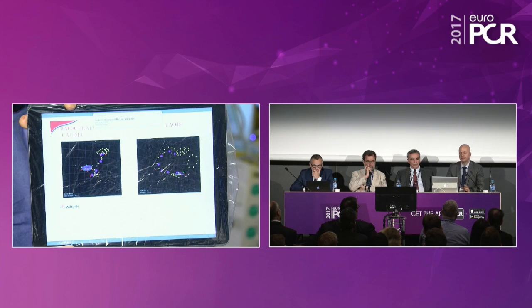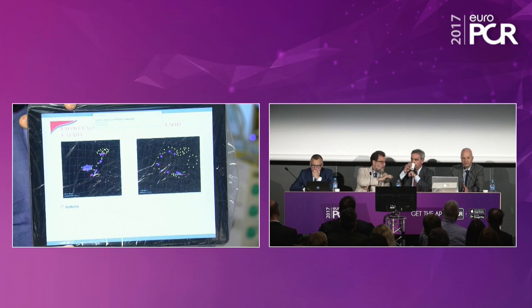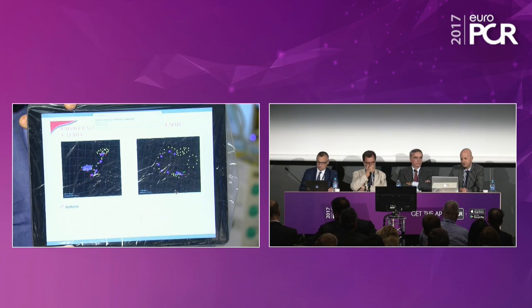I may stop here. And you have a complete workup up front. You do echo, of course. You got to be convinced that TR is severe and that clinical symptoms are related to TR. And then you have to do a CT scan. The CT scan tells you vicinity of the right coronary artery to the hinge points of the tricuspid. And it also tells you the diameter, which band to choose. There are various sizes, 6 or 7 sizes available. In most cases, we need the largest size. Actually, we don't have large enough implants so far, but the company is working on this because it's a huge valve.